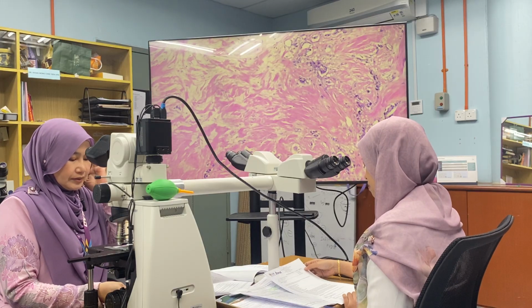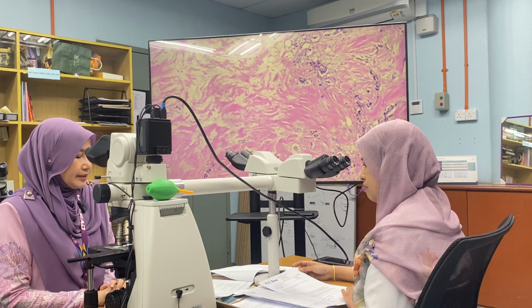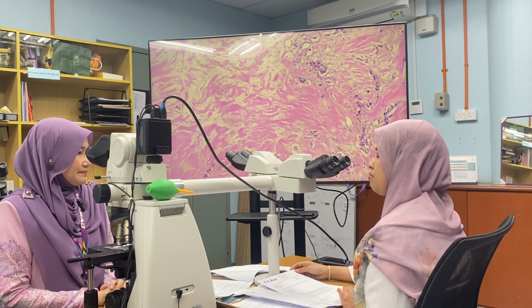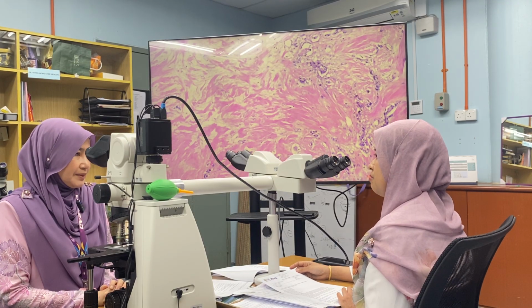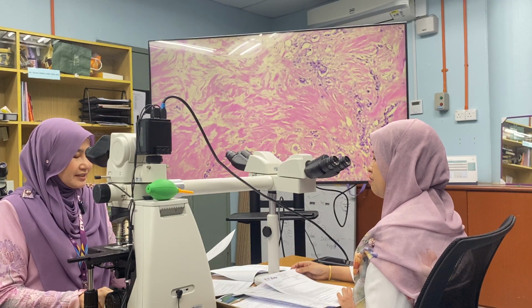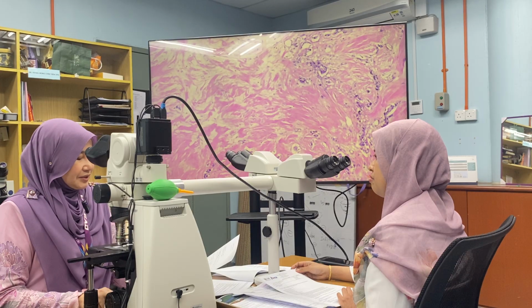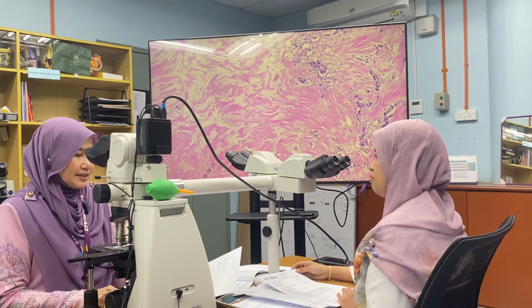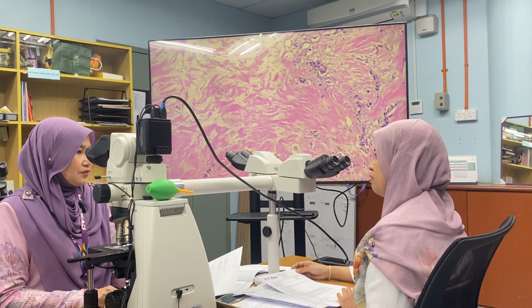Before I proceed with another question, thank you for picking up this case. I think you know that a post-neoadjuvant chemotherapy specimen is quite challenging for us to evaluate. First of all, why do you think they proceed with neoadjuvant chemotherapy before surgery?